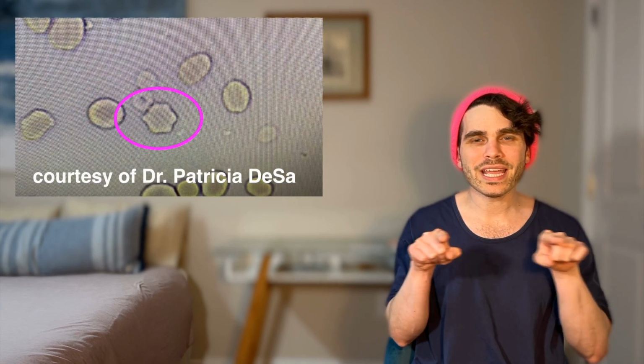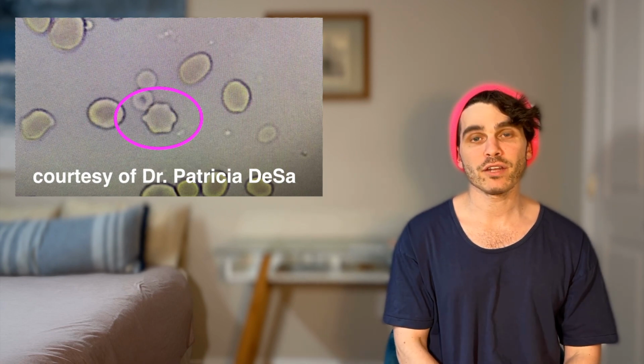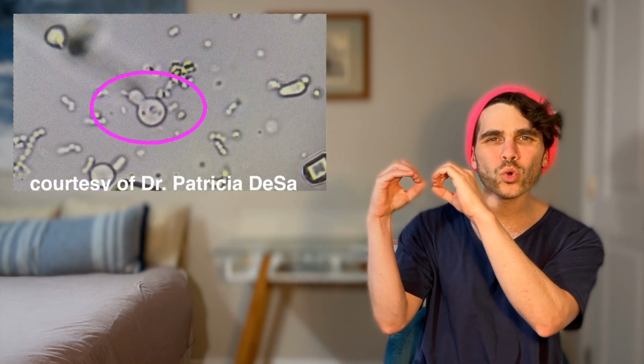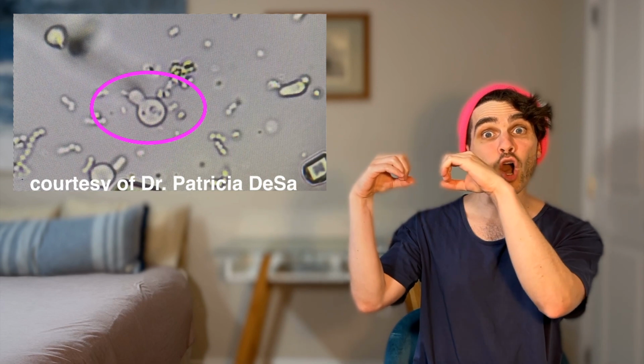If you see more than 3 to 5 RBCs in a high-power field, we will call that microscopic hematuria. Dysmorphic RBCs is when you have a disheveled or disgruntled cell membrane of the RBC. Acanthocytes is a specific vocabulary word that we use for dysmorphic RBCs that have globules or corpuscles that sort of bleb off of the main cell membrane. They're often likened to Mickey Mouse ears.